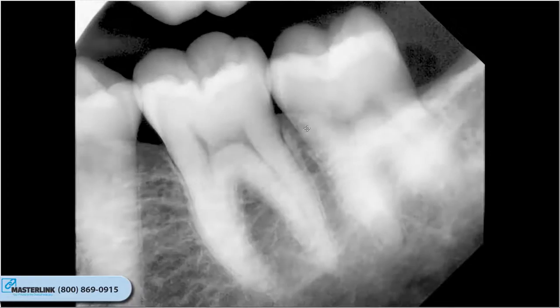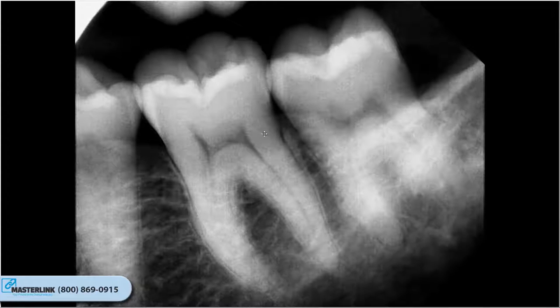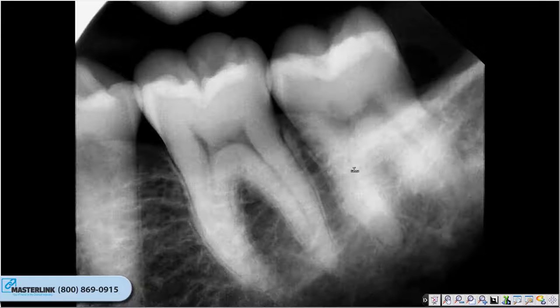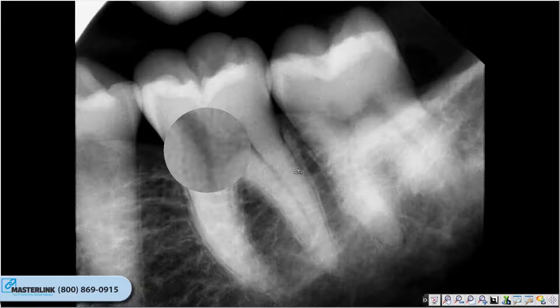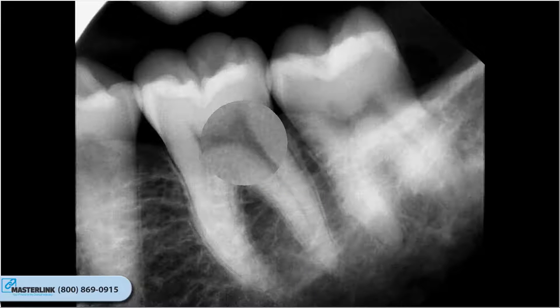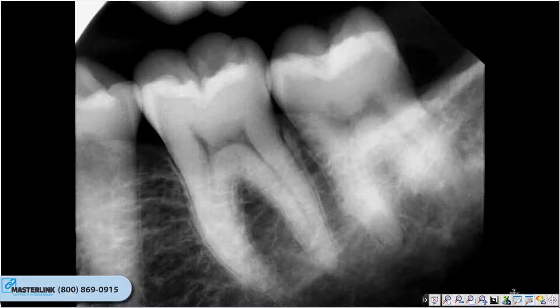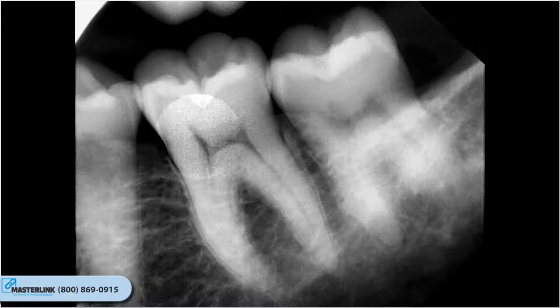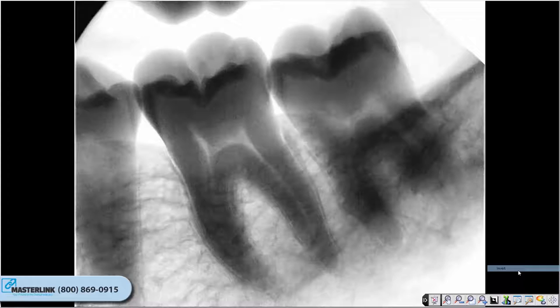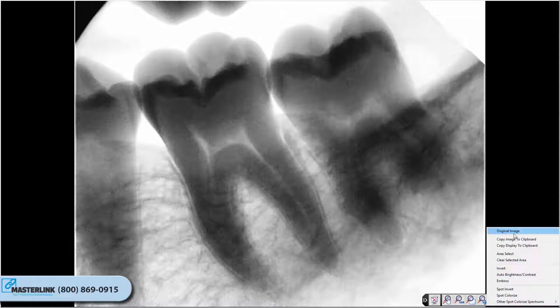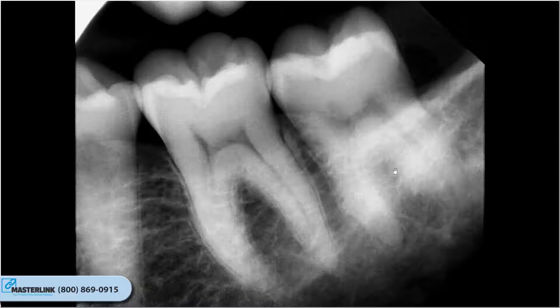To adjust the gamma, click on the icon to activate, then single left-click and hold the mouse and move the cursor left to increase or right to decrease the gamma. The Spot Magnifier button zooms into a user-specified area by clicking and holding the left mouse button. Right-clicking creates a zoomed area that remains displayed until the user clicks on the image again. Double-clicking allows the user to change the size and magnification level of the zoomed area. The Spot Enhancer functions like the Spot Magnifier but stretches the histogram of the selected area, exaggerating differences in density within the circle. The Other Enhancement Tools button contains less frequently used options such as Emboss and Invert. The Navigation arrow button turns the mouse cursor into a hand, allowing the user to click and drag on a zoomed image to navigate to different areas.